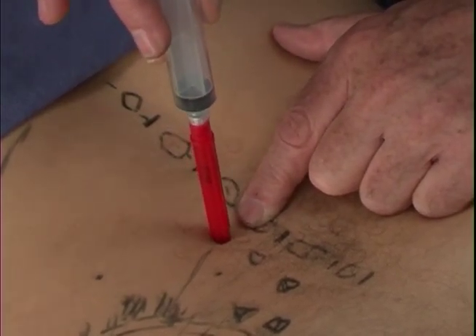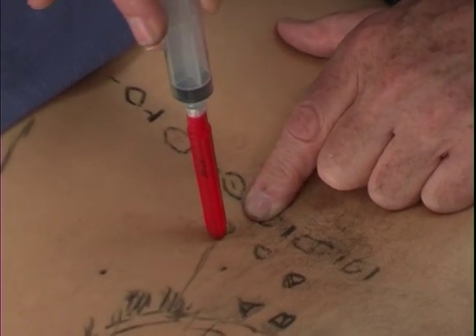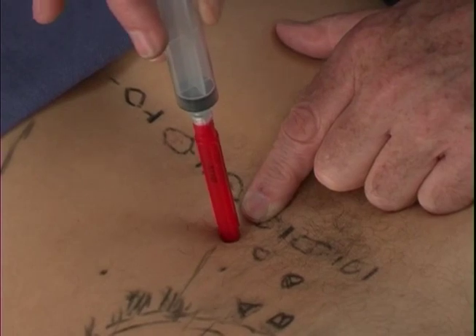We can also, if we wish, walk our needle off the edge of that just to orient ourselves to the space a little bit closer.